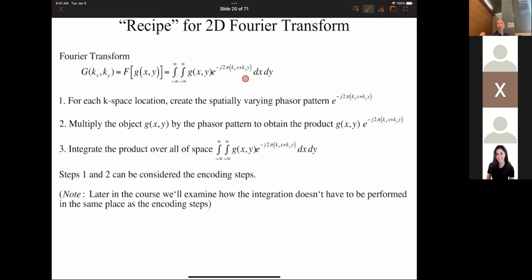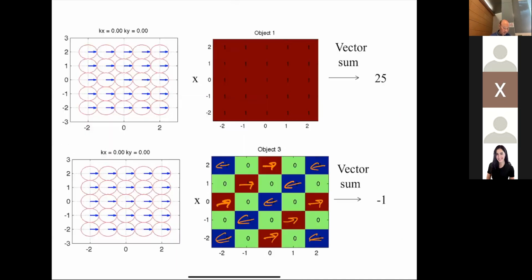It depends on your sample. The other place where you really have to go quickly is little kids or babies, right? Basically, you either have to figure out a way to scan them very quickly, or figure out how to scan them even as they're moving. Okay, so that's the trade-off. But yeah, those are great questions. Okay, so everyone okay with this example, the vector sum?